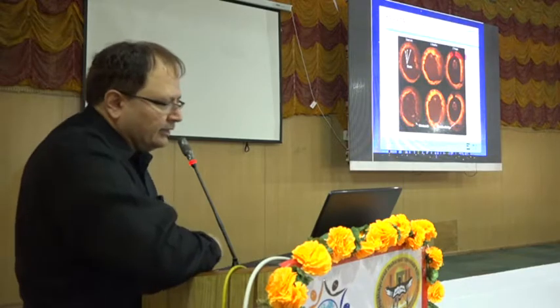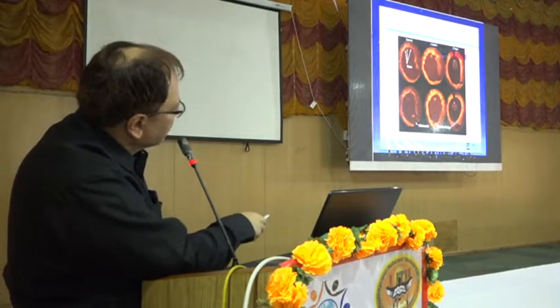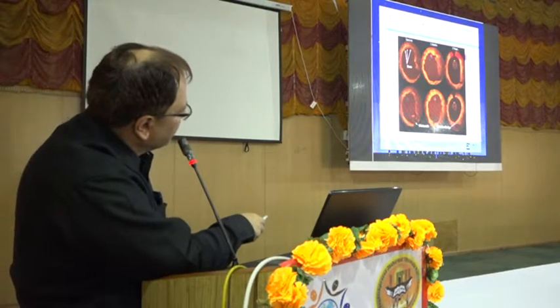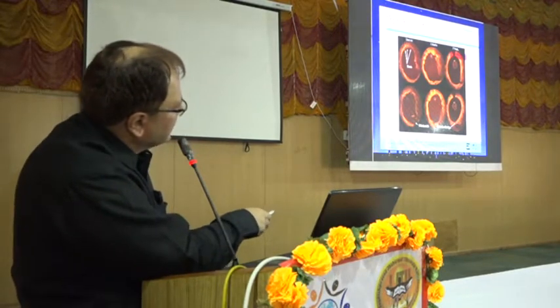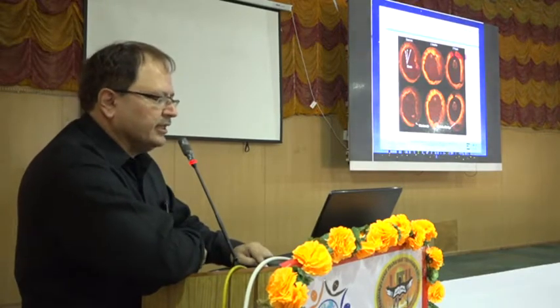You can see this absorbable stent in the OCT images. At the baseline, you can see the struts here. After 6 months, there is a smaller number of struts you can see. And after 2 years, the stent has dissolved altogether. So you cannot see the stent after 2 years.